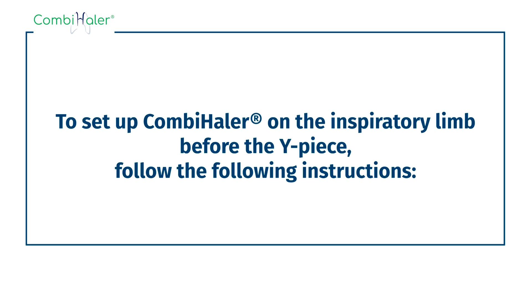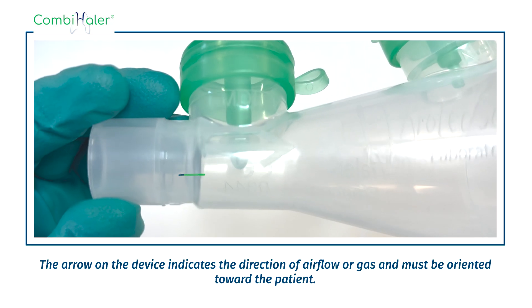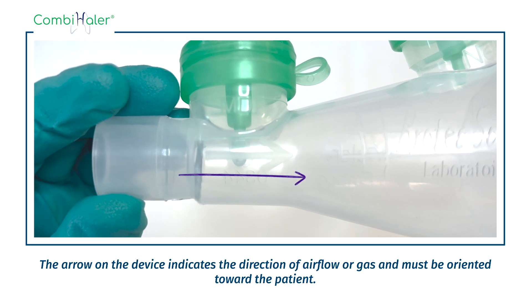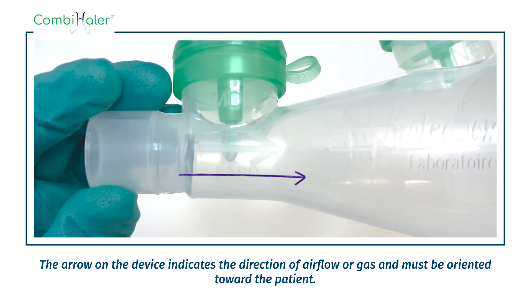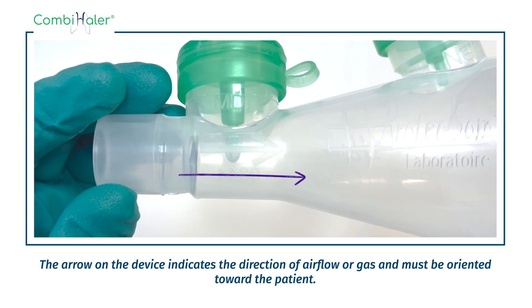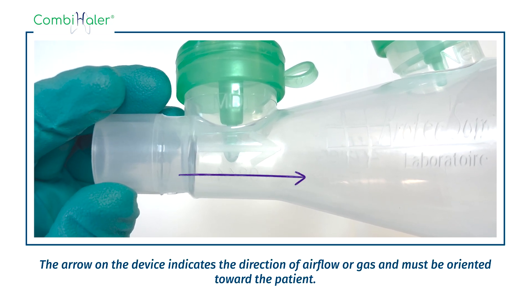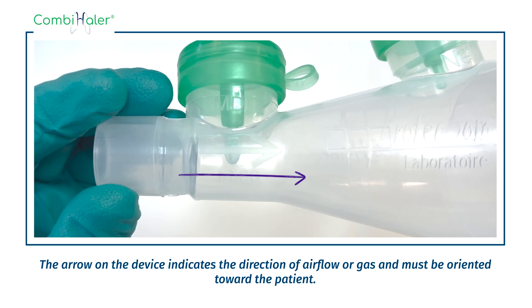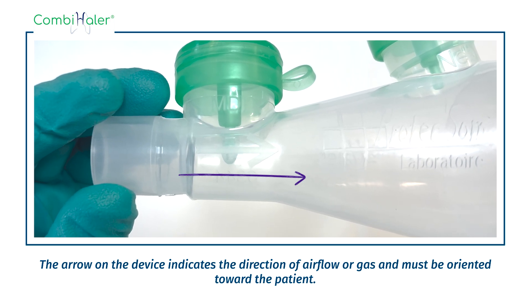To set up Combihaler on the inspiratory limb before the Y-piece, follow the following instructions. The arrow on the device indicates the direction of airflow and must be oriented toward the patient.